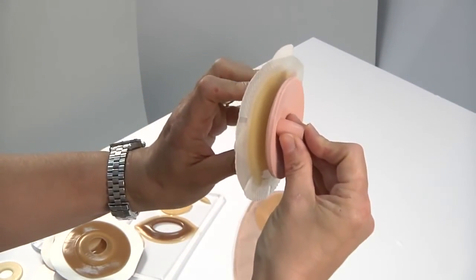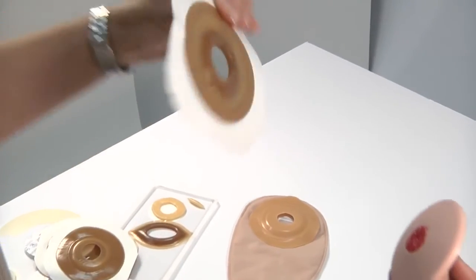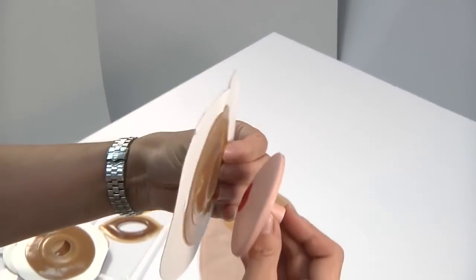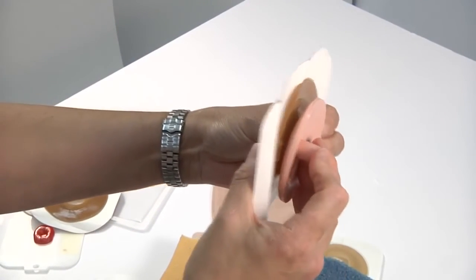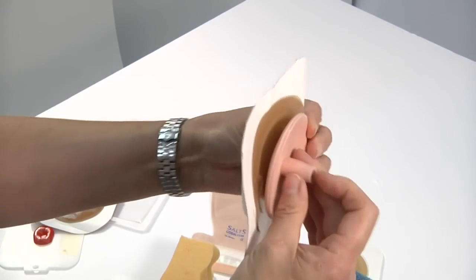And again, you've still got a bit of a gap, so maybe this is where you're taking your one piece or your flat barrier and adding just a little bit of a ring onto the back, because you've got more flexibility and it's actually going to fill into the gap.